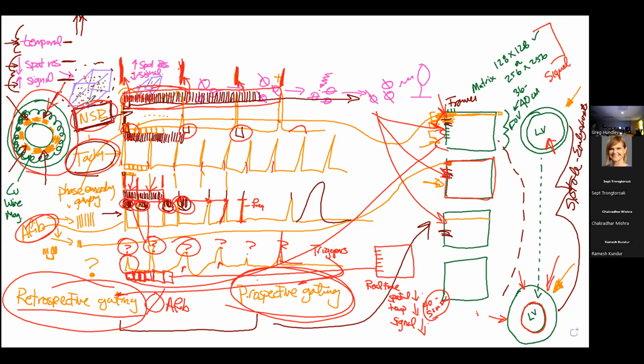There will, however, be points of time where we can't find the triggers. Now, when you can't find the triggers, it's not like, oh, let's go and switch to real time. What you should do if you're a technologist, if you're a fellow, if you're a nurse, if you're whatever, is go in, reposition the leads, try to figure out a way so that you have some type of consistency. It can be anything. It can be the pulse. It can be whatever, so that you can capture images using one of these other methods. But if you can't, then you can switch to real-time imaging.